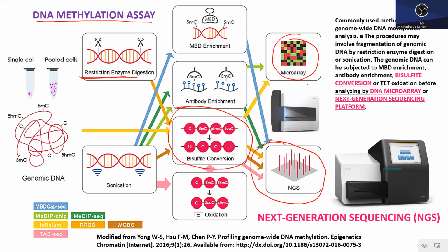This combination of tests yields a huge amount of information. It yields information about mutations, as well as about copy number variations. And the CNVs, or copy number variations, are very important in the diagnostic workup of brain tumors, as we shall see subsequently. So over here, you have a methylation profiling scanner, and this instrument below is the next generation sequencing machine, one of the machines in the portfolio of Illumina.